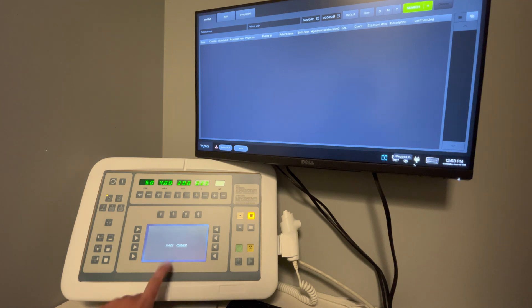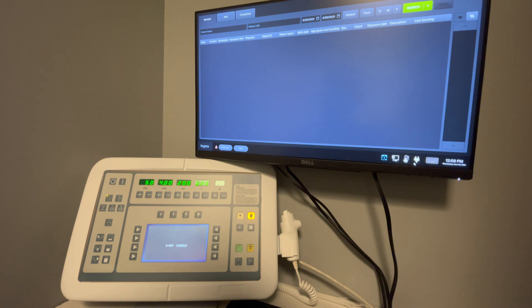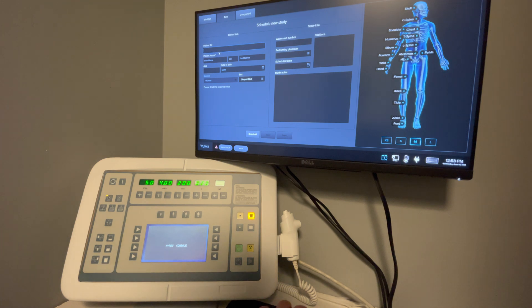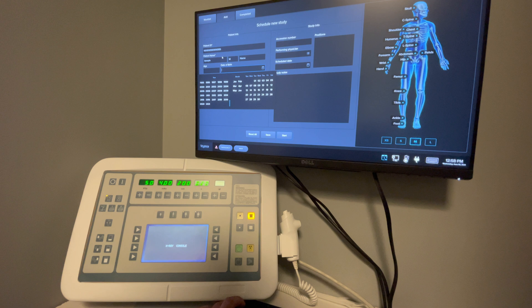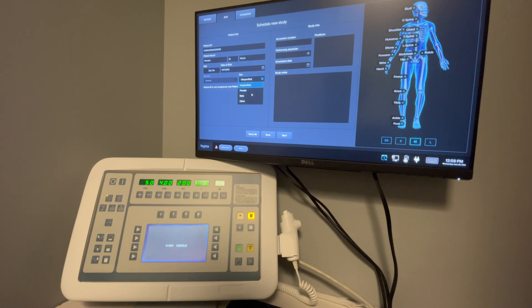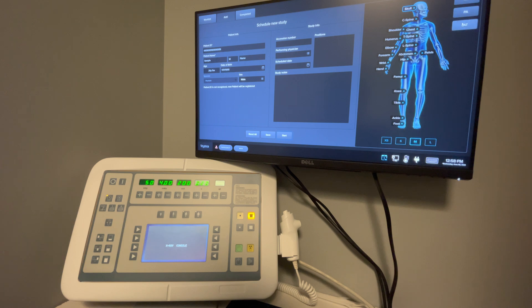Now we see the x-ray console. We can choose the anatomical programming, which allows you to choose different body parts to take an x-ray. First, I'm going to add a patient by entering patient information: patient ID, patient name, date of birth, sex, and I can choose a performing physician and schedule date. I can also add notes about the particular study, then choose the anatomical regions and the view — AP, lateral, or PA.